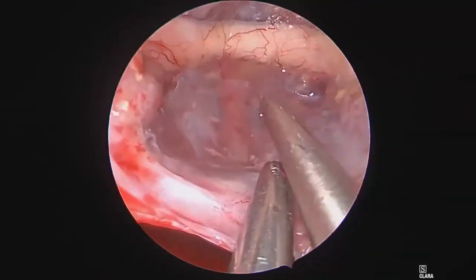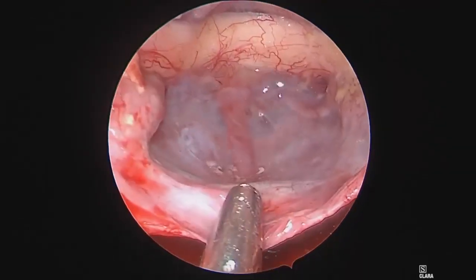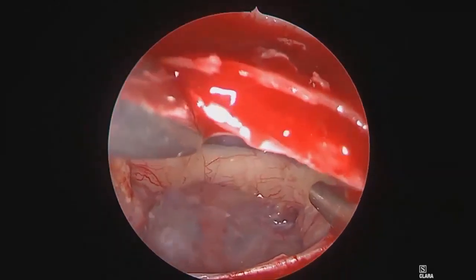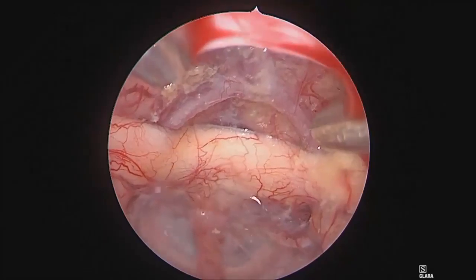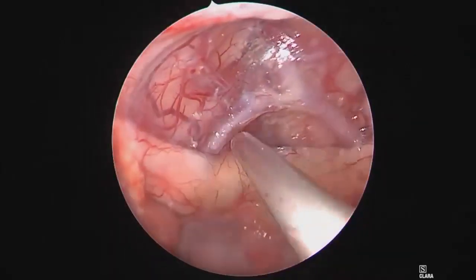Here we can see a thin veil of arachnoid protecting the optic chiasm and bilateral optic nerves, as well as a pituitary stalk right in the midline, with excellent decompression and good pulsations of the brain. Inspection of the surgical cavity in the suprasellar space with a 30-degree endoscope allows us to have direct visualization of the optic chiasm and the intracerebral arteries, as well as the ACOM complex.